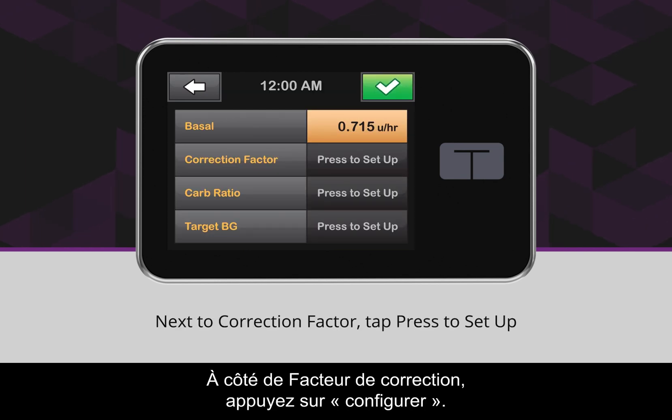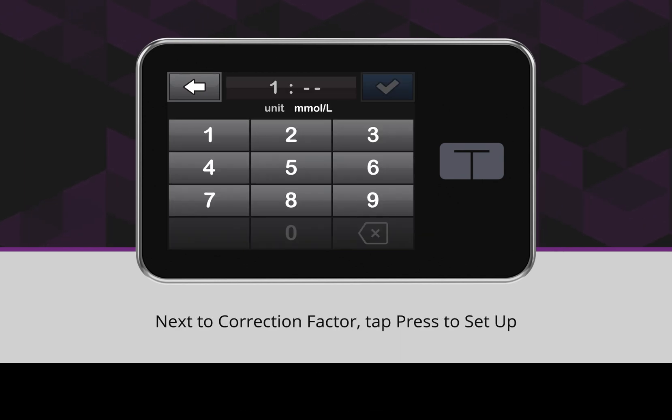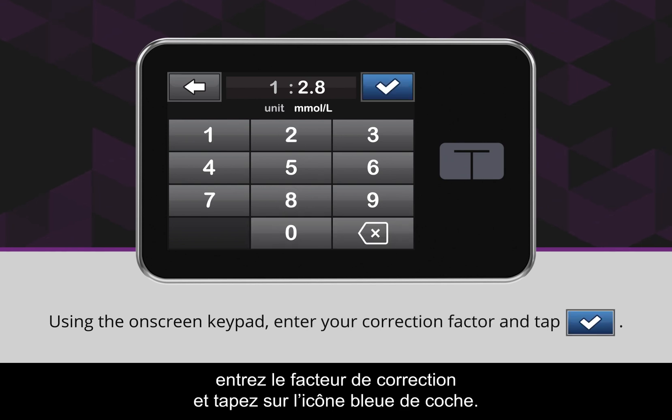Next to Correction Factor, tap Press to Set Up. Using the on-screen keypad, enter your correction factor and tap the blue checkmark icon.